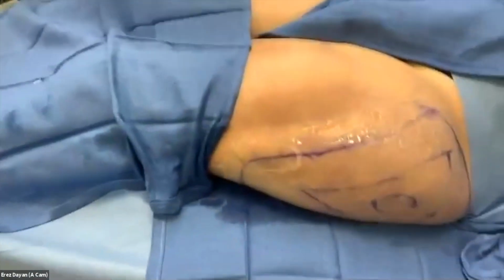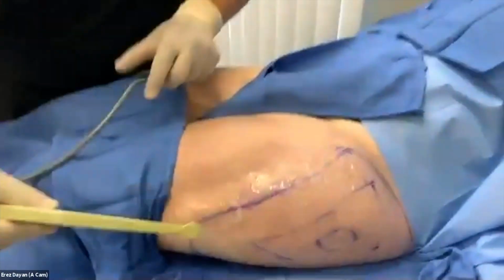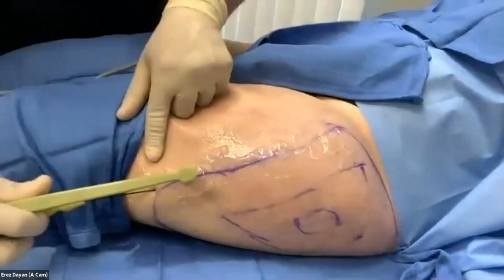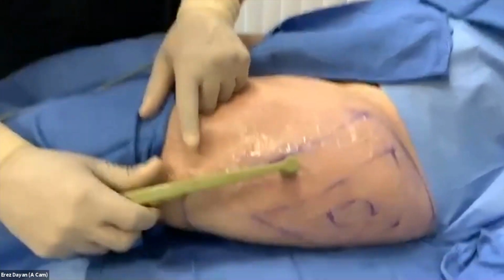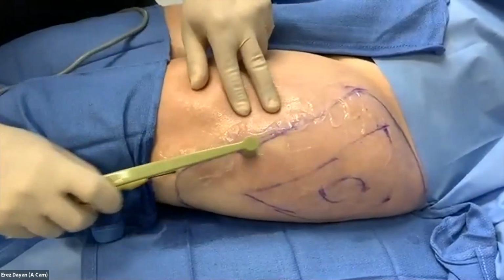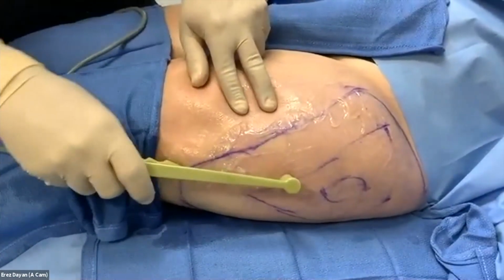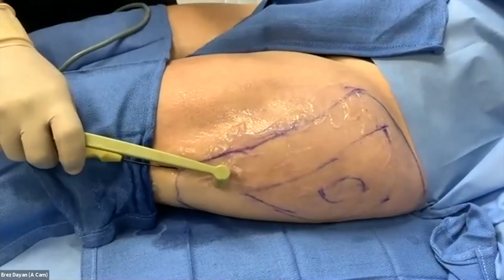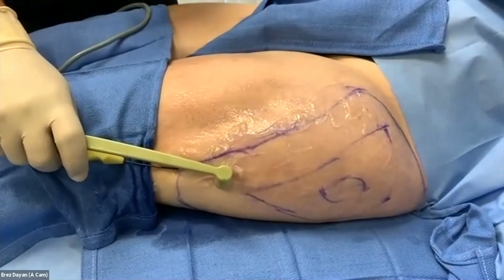Okay, so here's our applicator. I'll probably make another hole here, but I'm just kind of pre-tunneling, making it very easy for me to pass through this area. Now basically I look at this very systematically. I'm going to go row by row, heat this area to target temperature. You're going to hear audible alerts. The nice thing about the machine's behind me, I don't even have to look at it.